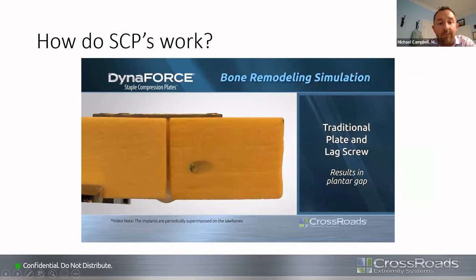One of the viewers asked a question earlier. Let me see. It was Blake. So this one is for you, not Blake Moore, my partner. He's on the call too. He was asking about how does a staple compress after you've already locked the screws in?